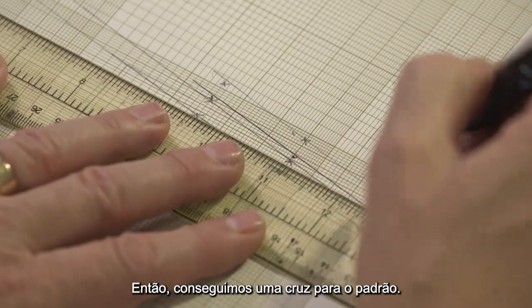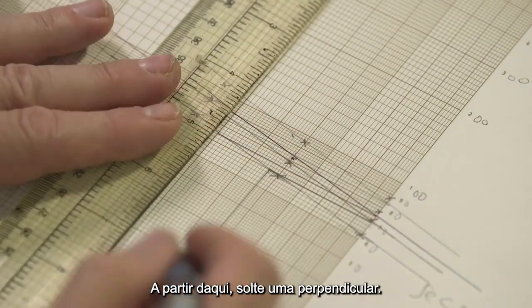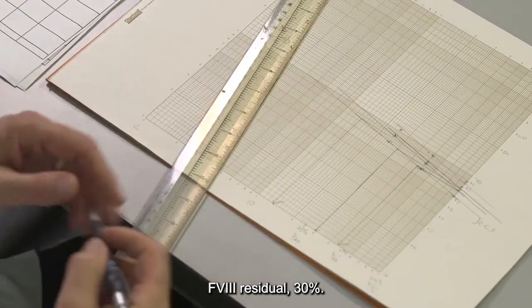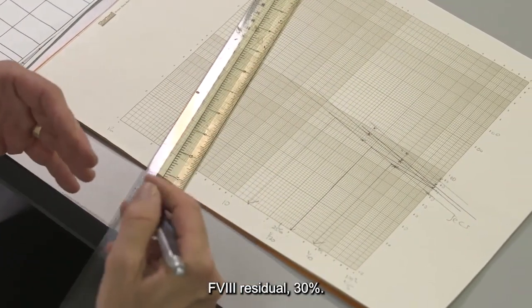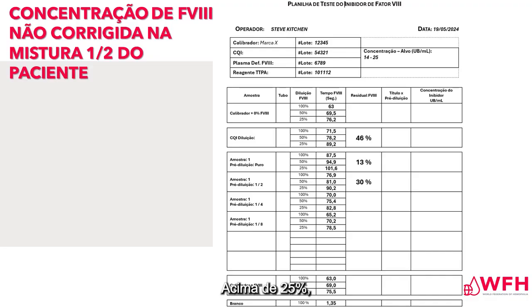So we go across to the standard. From here, drop a perpendicular. Residual factor 8, 30%. Above 25, it's possible to make a quantitative calculation from this figure, which we'll do in a moment.